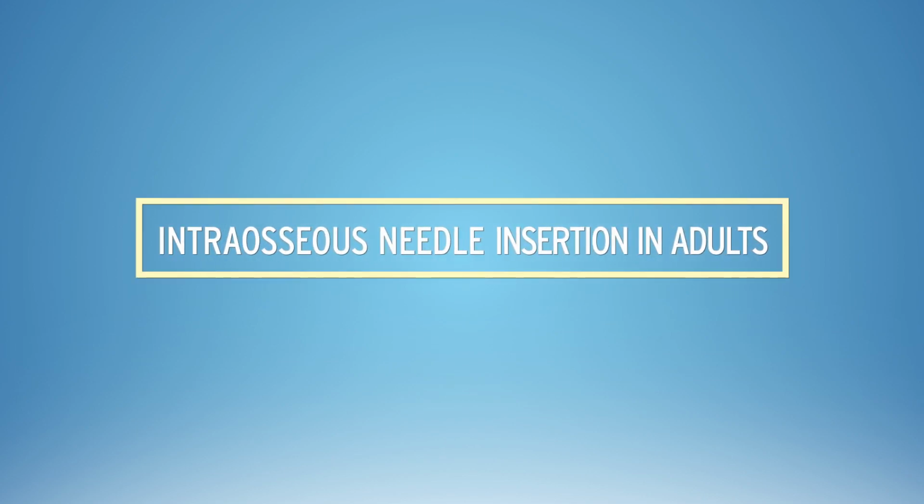Medical Procedure: Intraosseous Needle Insertion in Adults.